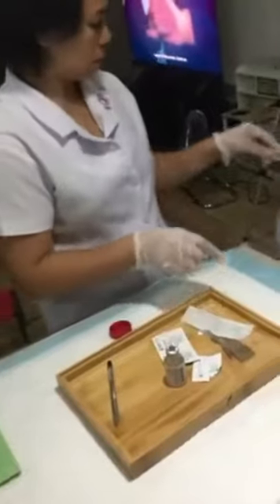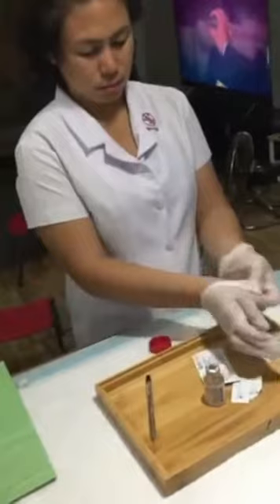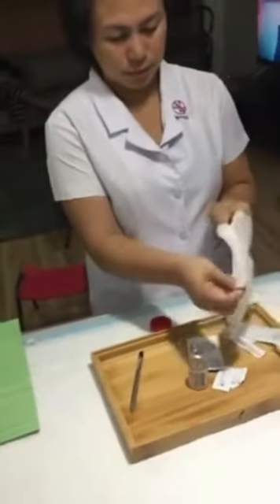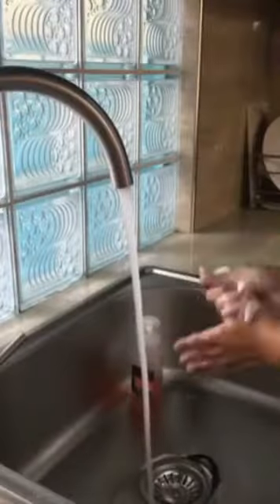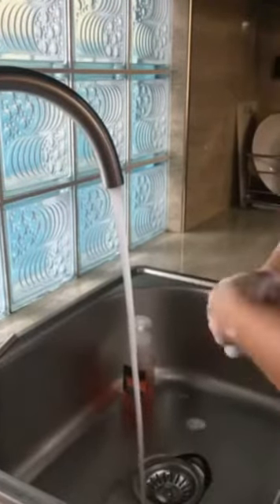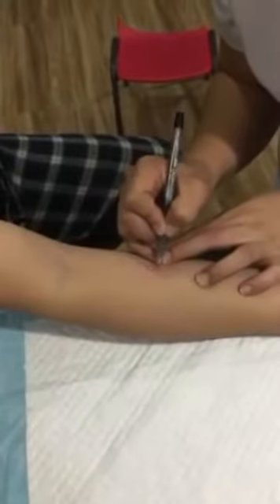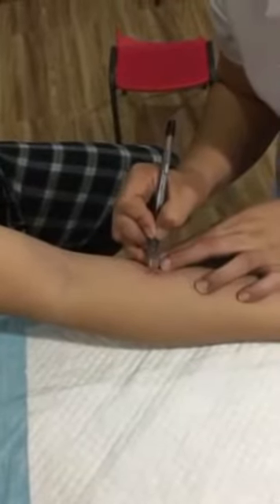Dispose of the syringe and needle in the sharps container. Do not recap the needle in order to prevent needlestick injuries. Remove and discard gloves. Perform hand hygiene. Circle the injection site with ink to observe the redness or induration (hardening) per agency policy. Document all relevant information. Record the testing material given, the time, dosage, route, site, and nursing assessments.